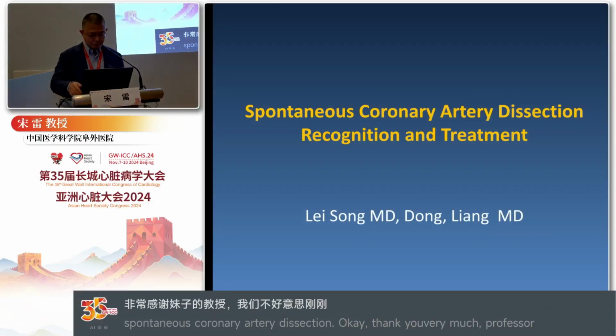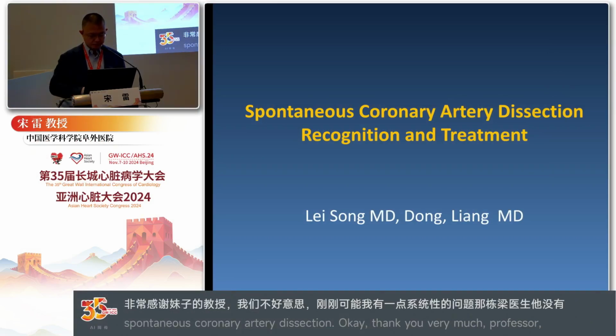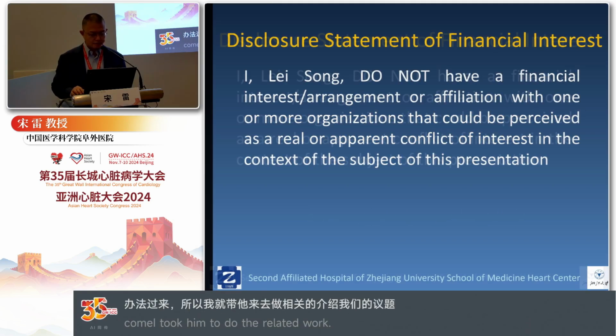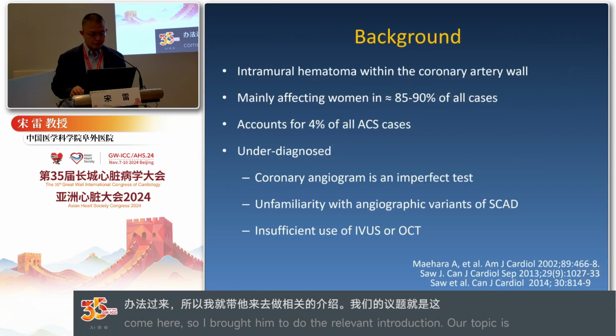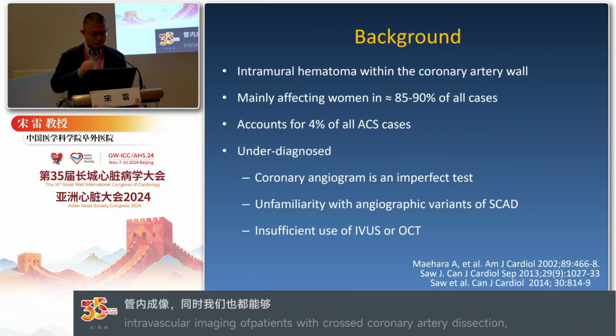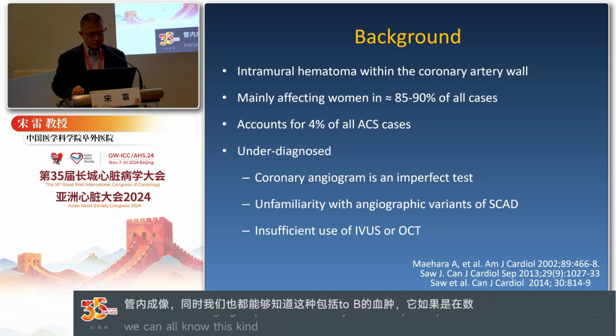Leon cannot come here, so I will perform this presentation. The topic is spontaneous coronary artery dissection, and I have nothing to disclose. An intramural hematoma within the coronary artery is what we call a spontaneous coronary artery dissection, mainly affecting women.